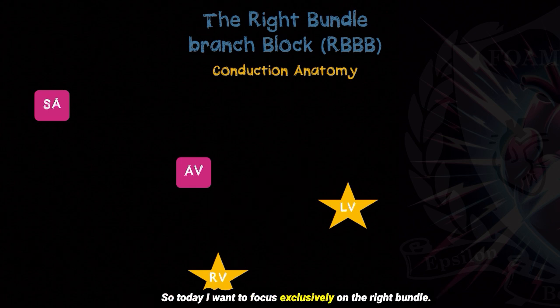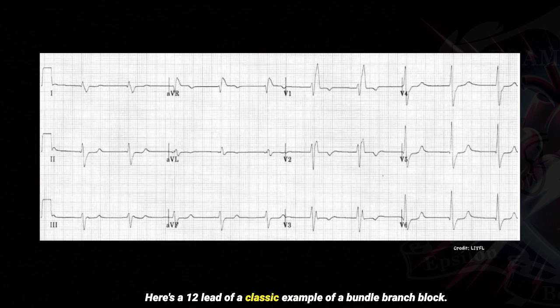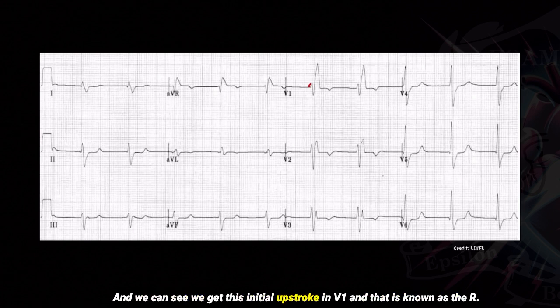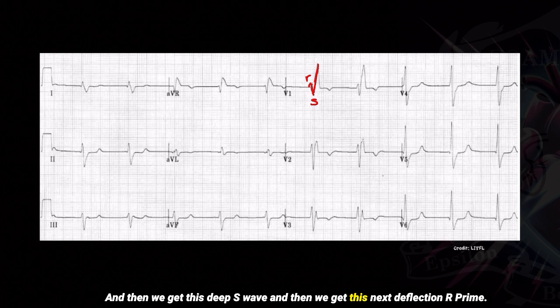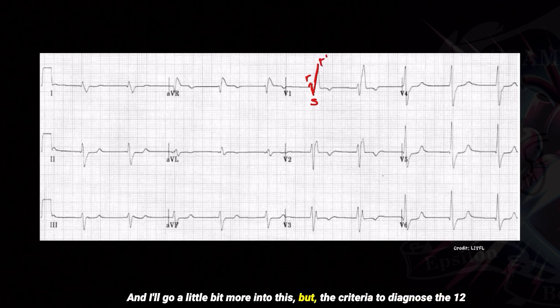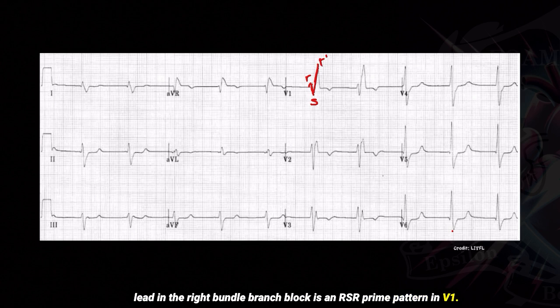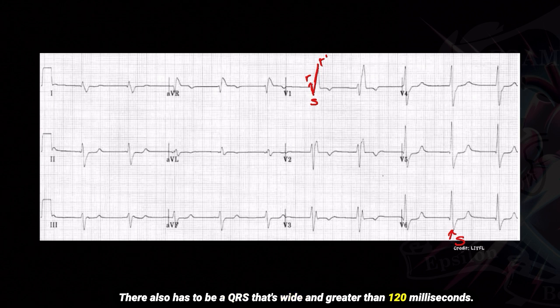Today I want to focus exclusively on the right bundle. Here's a 12-lead showing a classic example of a bundle branch block. We can see we get this initial upstroke in V1, known as the R, and then we get this deep S wave, and then the next deflection — R prime. The criteria to diagnose a right bundle branch block on a 12-lead is an RSR prime pattern in V1 and a deep S wave. There also has to be a QRS that's wide and greater than 120 milliseconds.